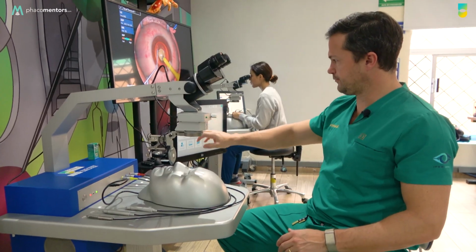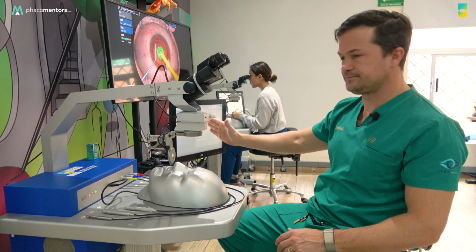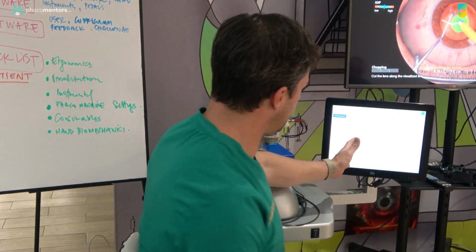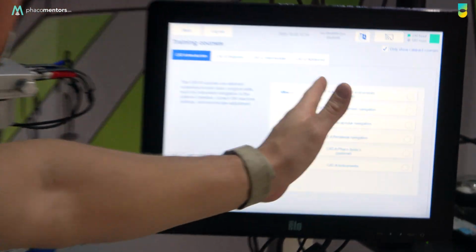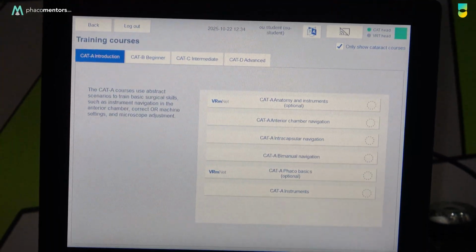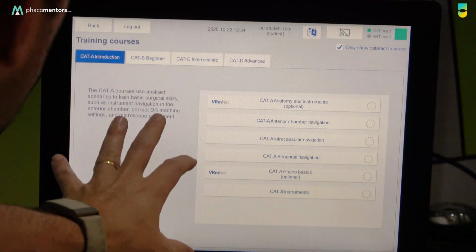As I told you, you have a user, and probably your mentor gave you a course. So you're going to have a curriculum, okay? This curriculum, in this case, is going to have 4 stages, the one we do. And then in the end, it's important too that you're going to have what we call a cataract challenge that we're going to talk about, okay?